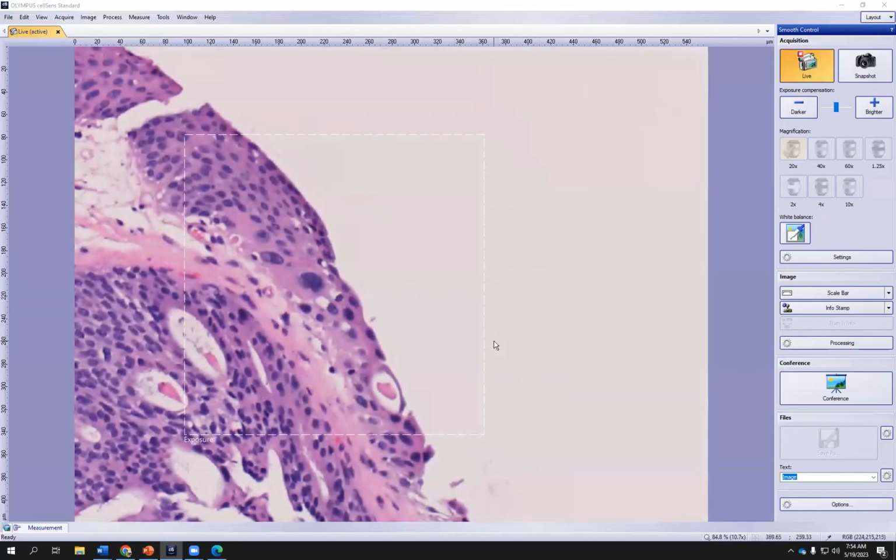Okay, that's one. And then the other feature is that the nuclei often have smudged chromatin. So you can see the smudgy, vague appearing nature of this chromatin over here compared to carcinoma in situ, where you find more often this vesicular or granular chromatin, right? And then the other feature is you don't really see nucleoli that are prominent in the degenerating umbrella cell. Okay, unlike carcinoma in situ in most cases.